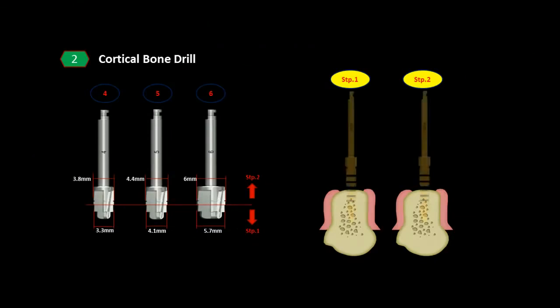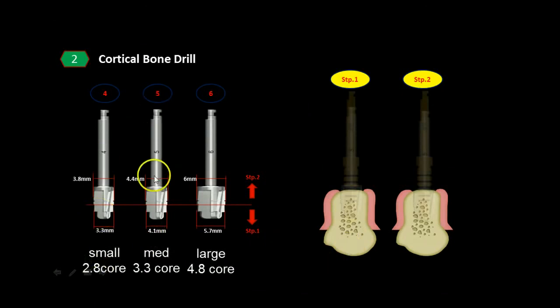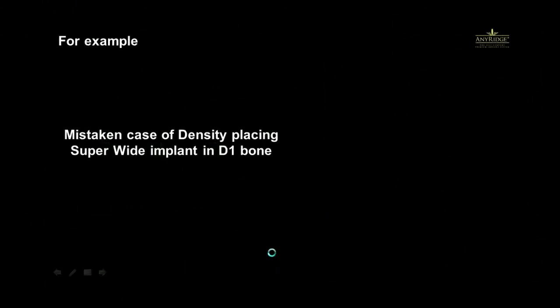One of the things to look at and utilize a lot with is your cortical bones. So after you made your osteotomy with whatever size drill you're going to finish with, and you do have some dense cortical bone at the top that will not allow you to place your implant to depth, simply use your small, medium, or large cortical bone drill, okay, and you place it right to the hub. Again, you want to think of this as small, medium, and large. So your small is only for your 3.5. Your medium cortical bone drill is really for your 4.0 through 5.5, and your large is for your 6.0 through 8.0 type implants. But again, actually 6.0 through 6.5. And the reason is because your wider, super wide implants, again, are mainly for extraction sockets, which we're going to talk about again in just a sec.